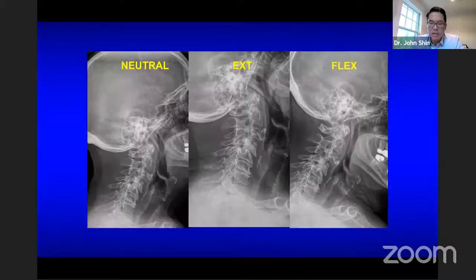So this is really an issue of severe cervical nerve root compression with some myelopathic features. And what is the strategy that's going to give you maximal nerve root decompression here? Are you going to be able to do that through a posterior approach alone? Is the posterior approach alone going to give you the benefit of addressing the alignment? You look at that extension x-ray, you can argue, well, that sagittal SVA is within 4 centimeters. So if you decompress and lock her in, you'll probably achieve that alignment.